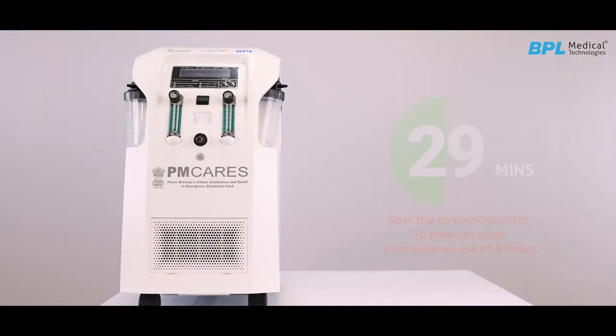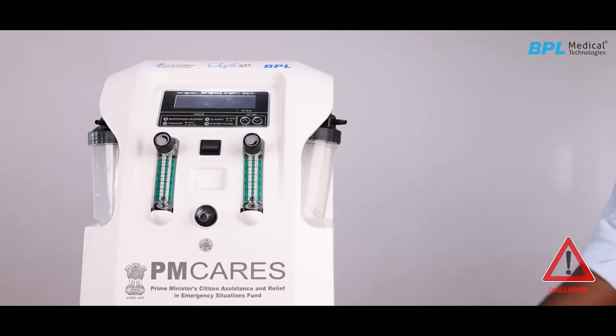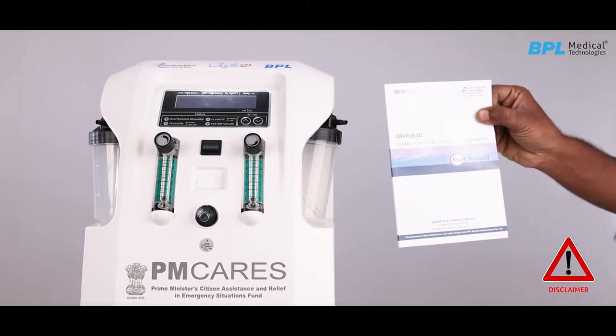Rest the concentrator for 30 minutes after continuous usage for 8 hours. Disclaimer: please refer to the user manual for detailed device usage and patient safety instructions.